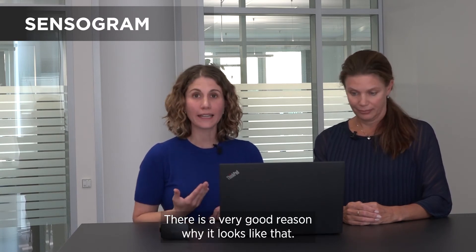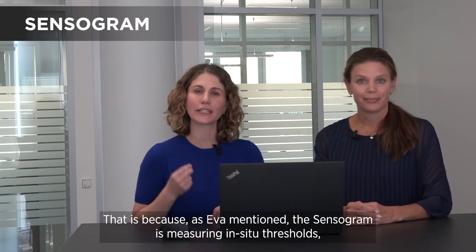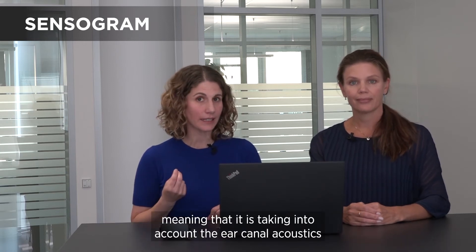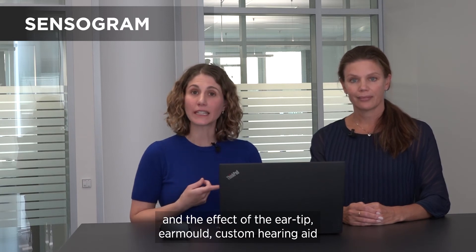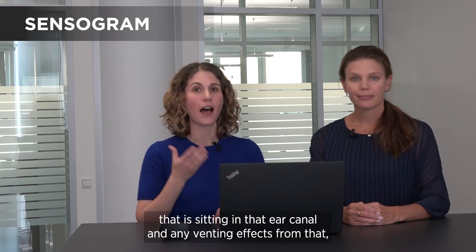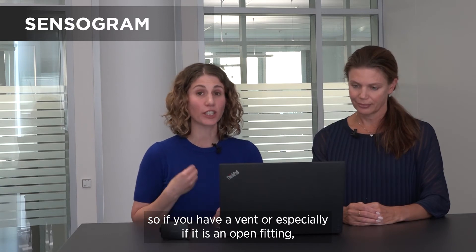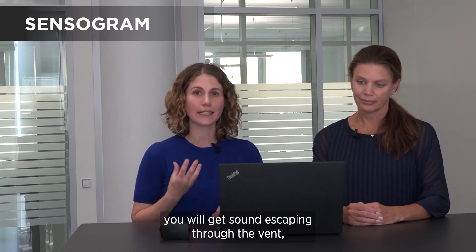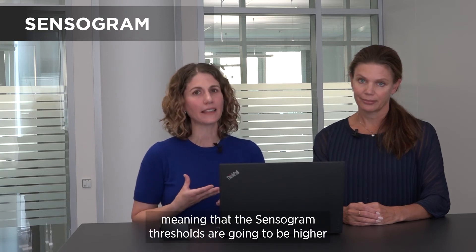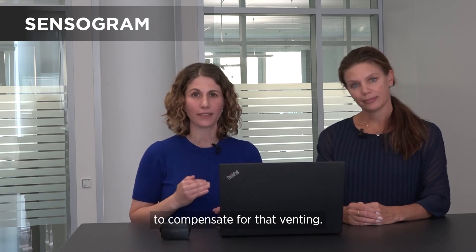There's actually a very good reason why it looks like that. The sensorgram is measuring in-situ thresholds, meaning that it's taking into account the ear canal acoustics and the effect of the ear tip, the ear mold, the custom hearing aid that is sitting in that ear canal, and any venting effects from that. So if you have a vent, or especially if it's an open fitting, you will get sound escaping through the vent especially in those low frequencies, meaning that these sensorgram thresholds are going to be higher to compensate for that venting.